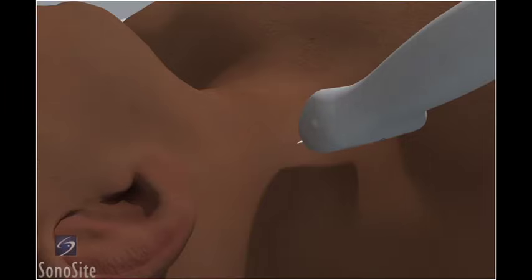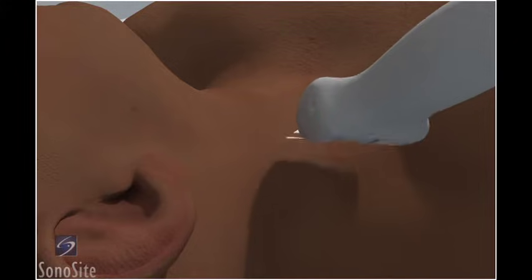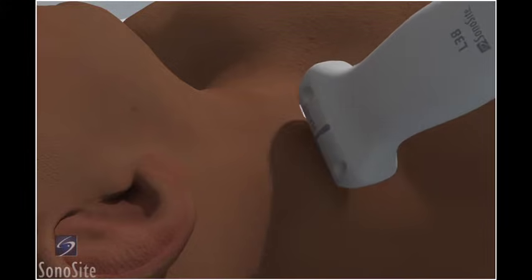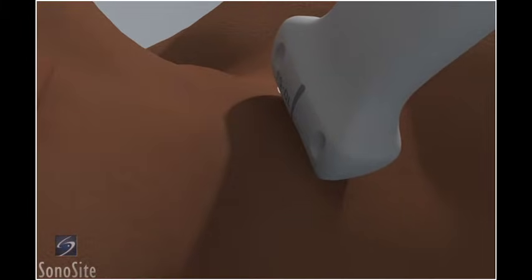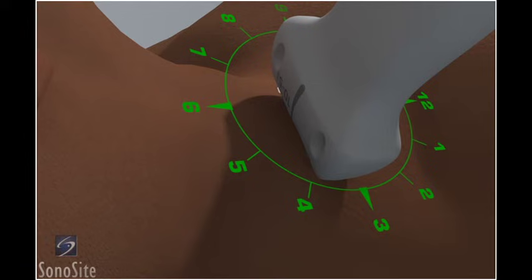The patient is in a supine position with the head slightly turned toward the contralateral side. The operator is positioned at the head of the bed. The transducer is placed transversely just below the apex of the sternocleidomastoid muscle triangle, with the orientation marker directed to the patient's left at a 9 o'clock position.